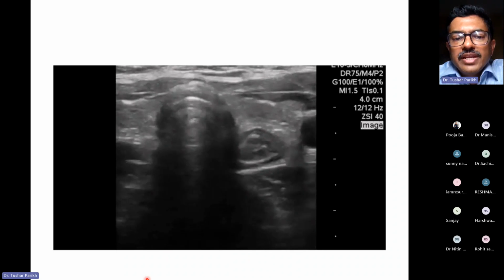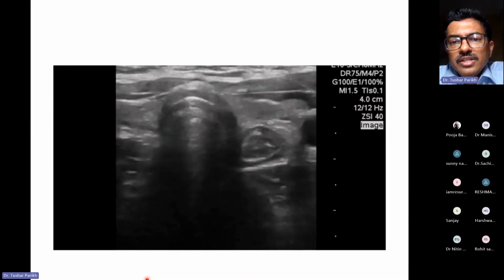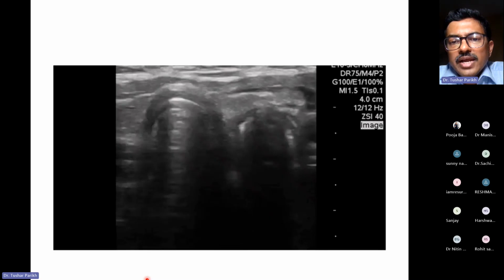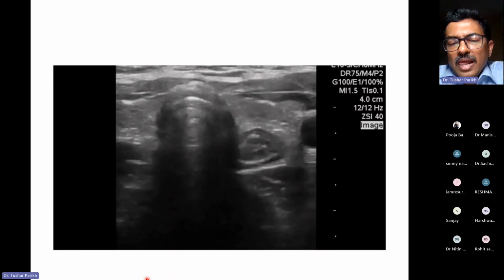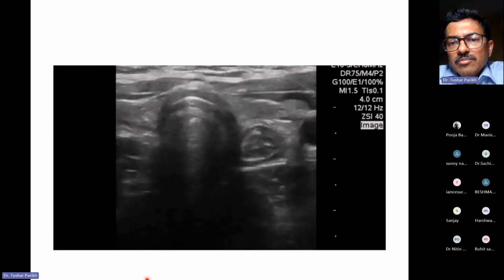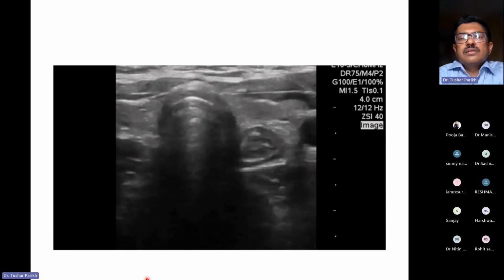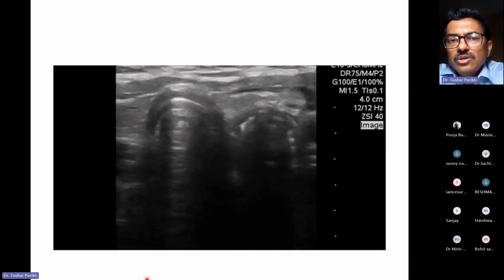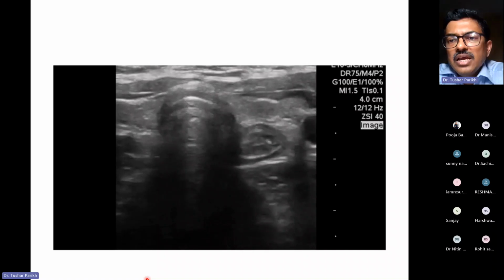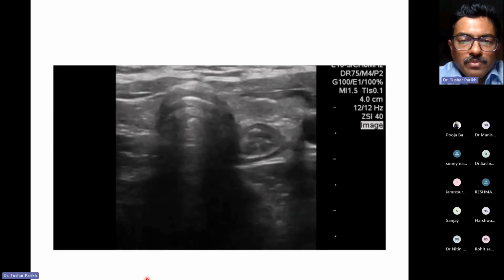So this is a very classical esophageal intubation, where after intubation you are not able to see within the lumen of the esophagus or anything beyond that. So it will cast a shadow, and that will be seen as a double trachea appearance. Now the tube is removed. Now the tube is put again. Now you have double trachea appearance. So again, this is something which is very easy to do. And again, as I said to you, you require a linear probe, high frequency, and you put it on the cricoid cartilage, and you check it. So again, this can be done for intratracheal positioning of the endotracheal tube.